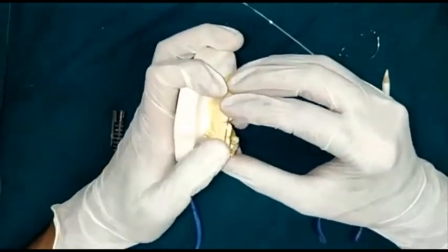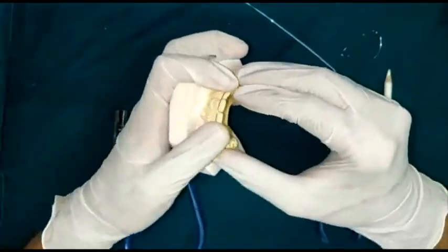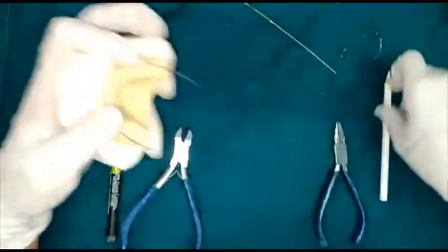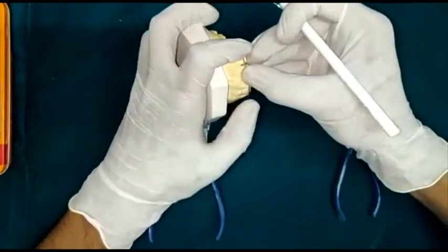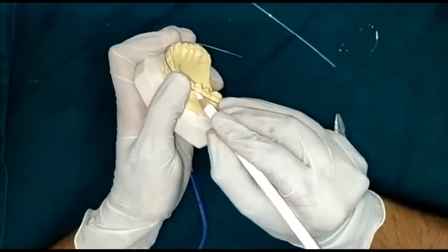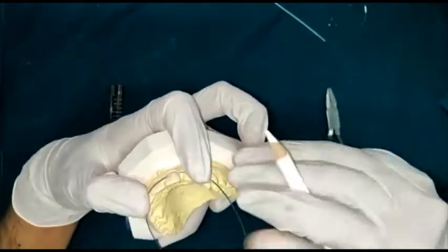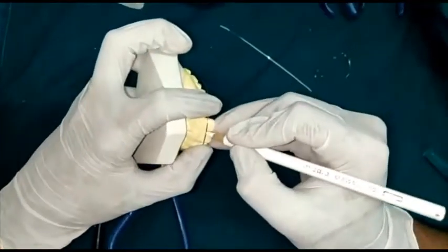You can adapt the wire with hands only — curve it and adapt it — and then you will do the markings. After adaptation on the labial portion, you will mark the mesial surface of the first premolar on both sides, and also mark the midline.